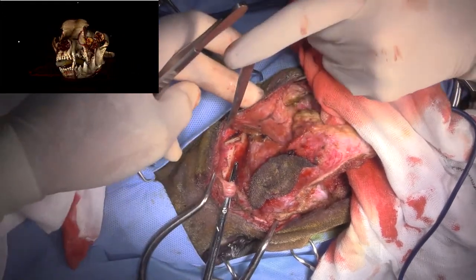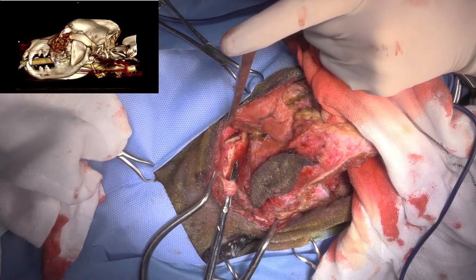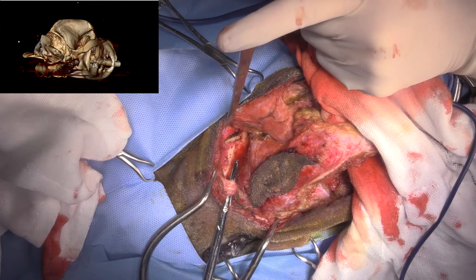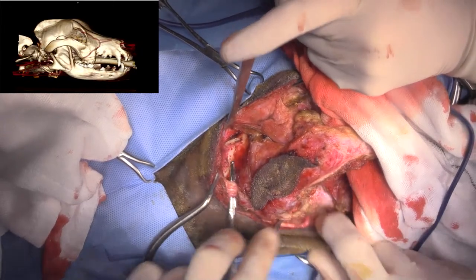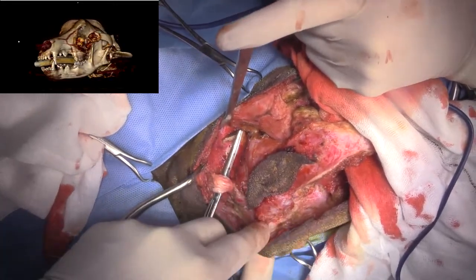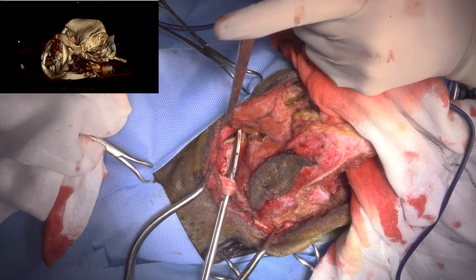So that's the palpebral fissure right there. That's conjunctiva right in there, and that's the whole optic cone with all the extraocular musculature. Go into the oral cavity here. I think we will. So this is going to be oral cavity right here, so we'll cut through that so that we can get exposure to the inside of the mouth. We can do that right now while we're waiting.